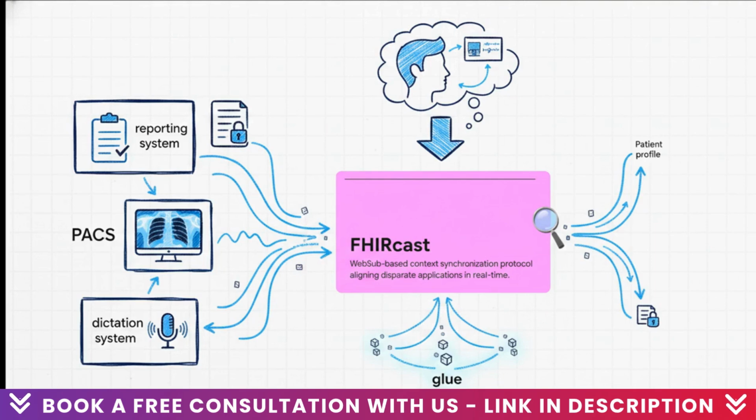But here is where the true magic happens. A radiologist is usually working across a reporting system, a PACS, and a dictation system all at the exact same time. To get a true single-pane workflow, you integrate FHIRcast. Modeled after the WebSub protocol, FHIRcast is basically the glue. It synchronizes context across all your different clinical applications in real time.